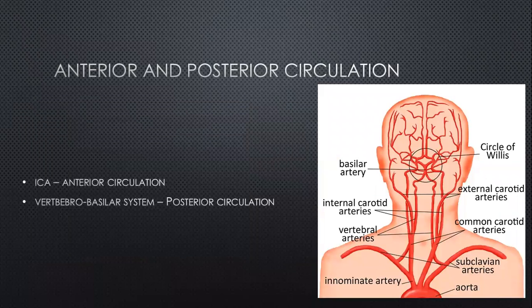Right, so that was kind of a brief background, if you like, as to how things have evolved over the phylogeny. So let's look at the traditional concept and try and understand this intracranial circulation. So of course we talk in terms of the anterior and the posterior circulation. The anterior circulation is the internal carotid artery and its branches, and the posterior circulation is of course the vertebrobasilar circulation and their branches.